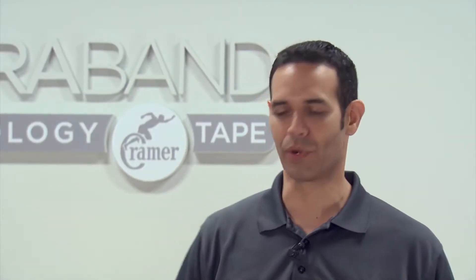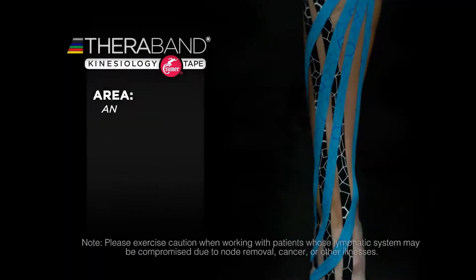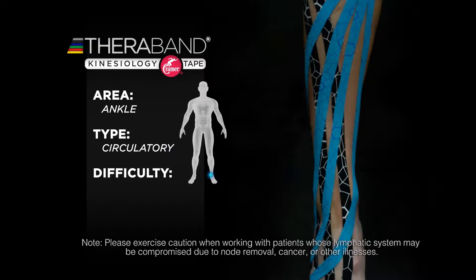Hi, I'm Dr. Greg Dorr, and what we're going to do is an edema reduction application using TheraBand kinesiology tape. We're showing this on the ankle, but this can be done anywhere in the body, anywhere that there's swelling.